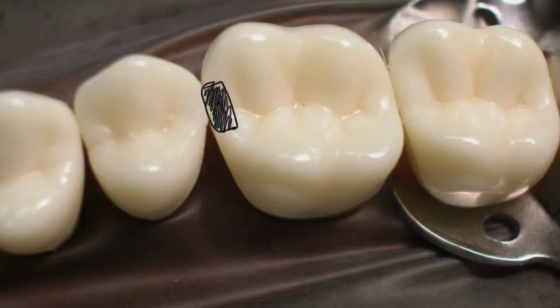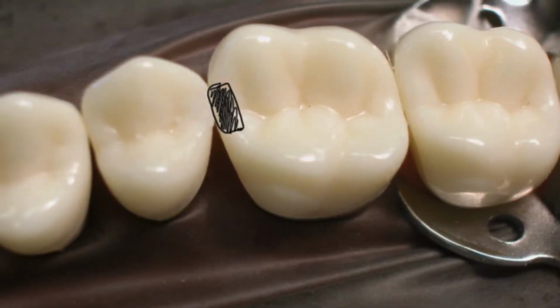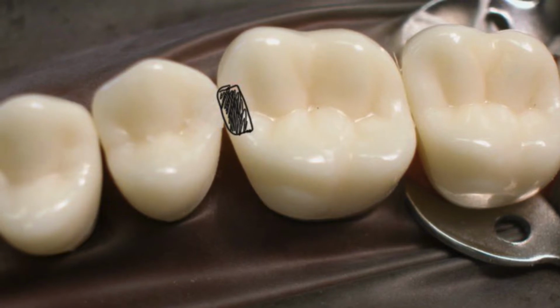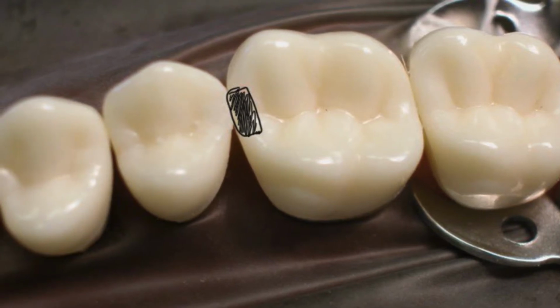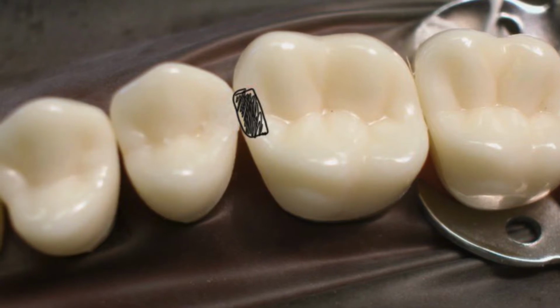The preparation that we're completing today will be a slot preparation on number 14. This is an example of a slot preparation on the mesial occlusal of number 3. For the slot prep, in preclinic, you will just break buccal and lingual contacts as well as gingival contact. No occlusal extension is necessary into the grooves.